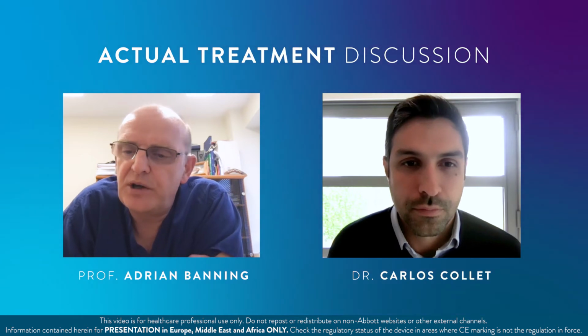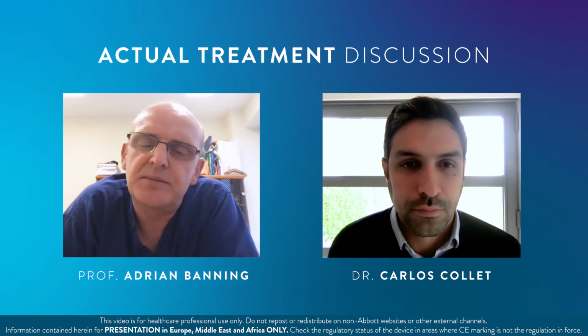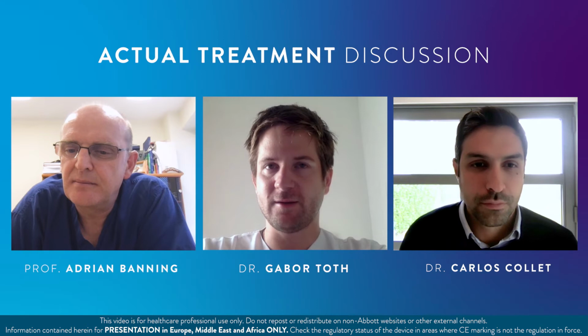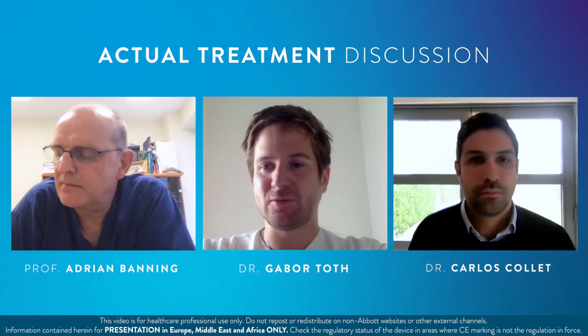So Gabor, what were your thoughts about the way that Carlos has managed to treat this bifurcation? It's a different story compared to when you see a native de novo stenosis and you have to select the technique. This patient already has a layer of stents in the side branch and a layer of stents in the main branch, and now you just go to optimize, or at least correct the results of that.